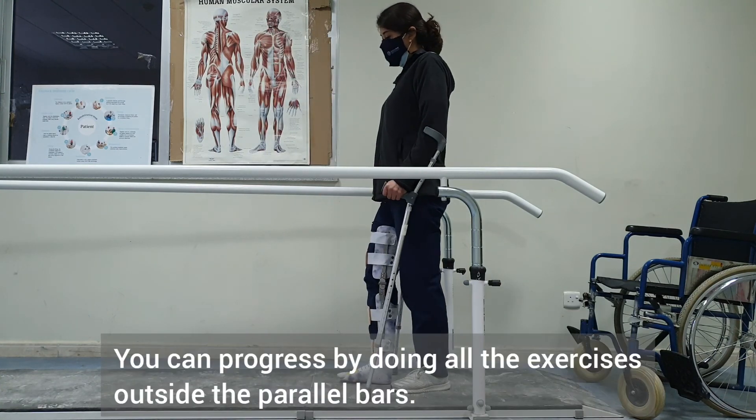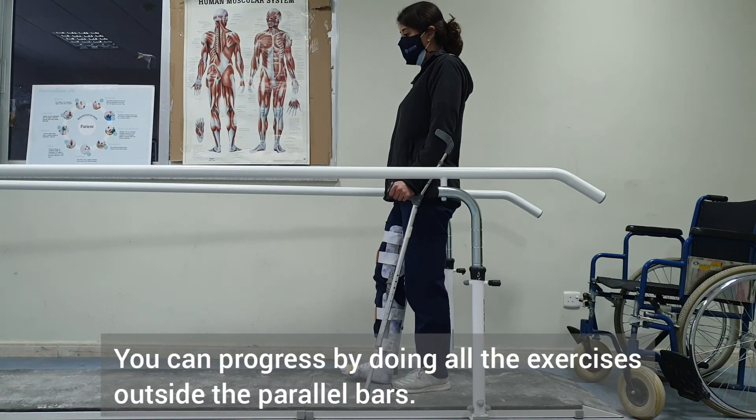After that, we will do all of this training again outside of the parallel bars.